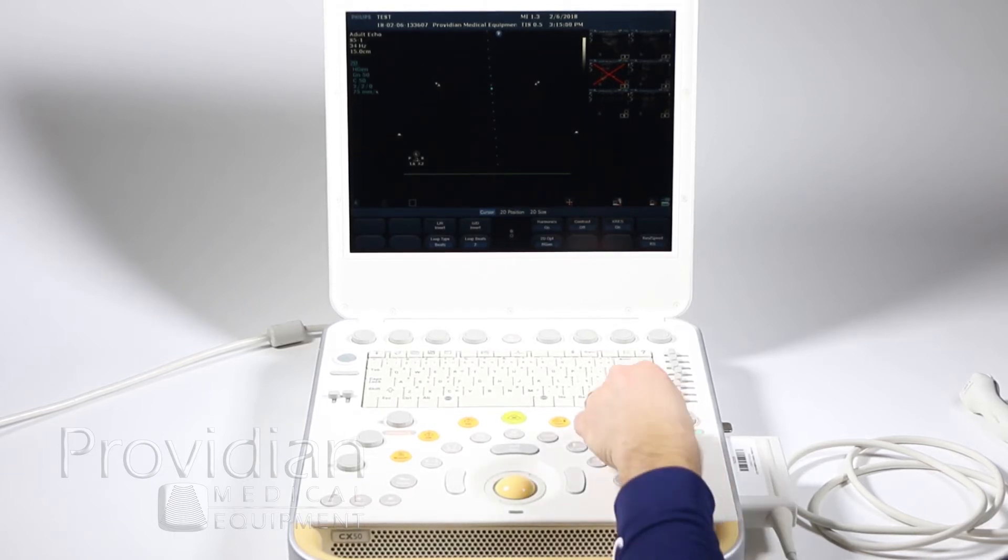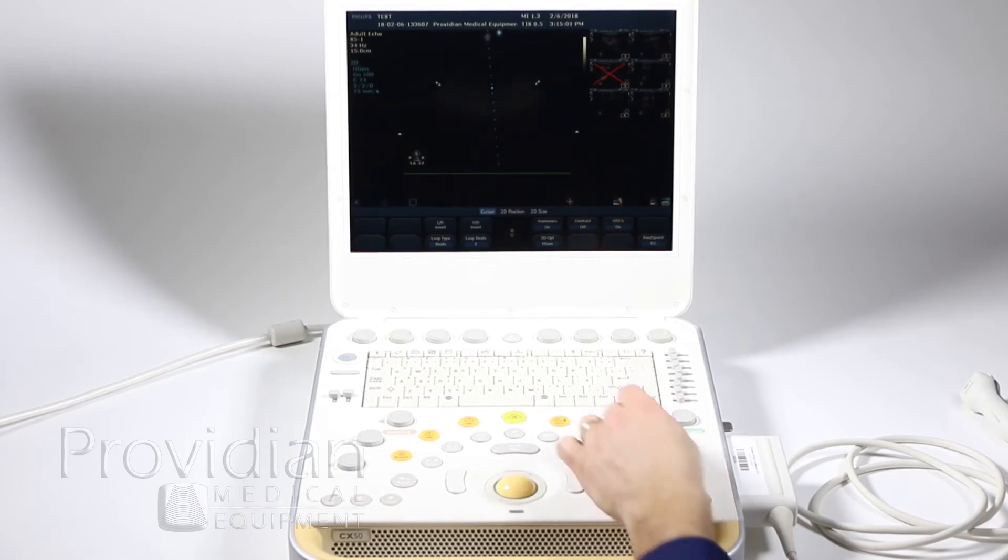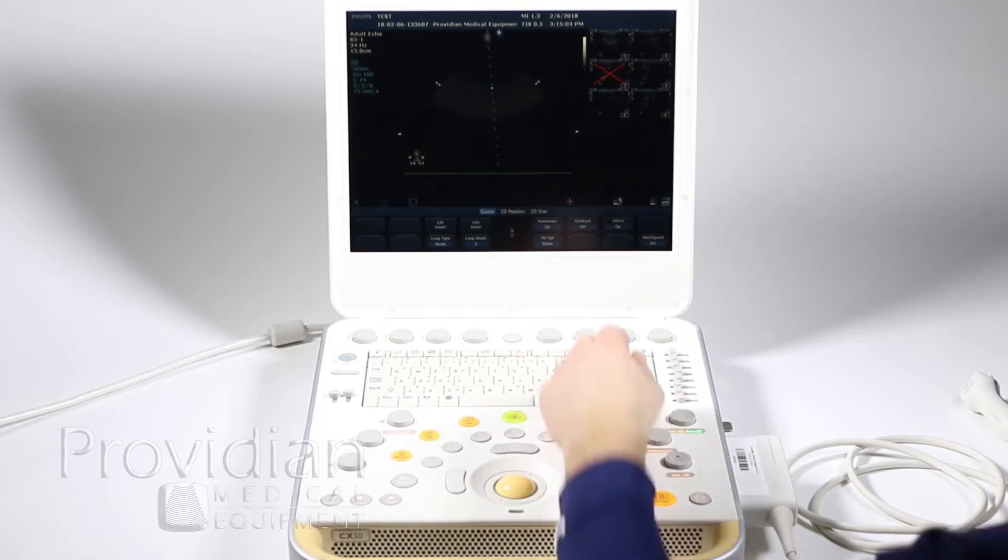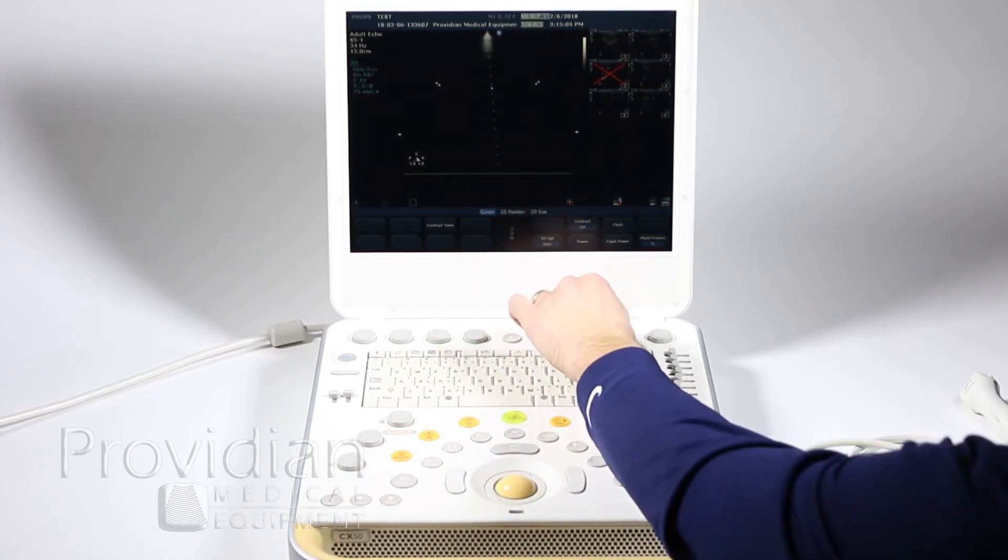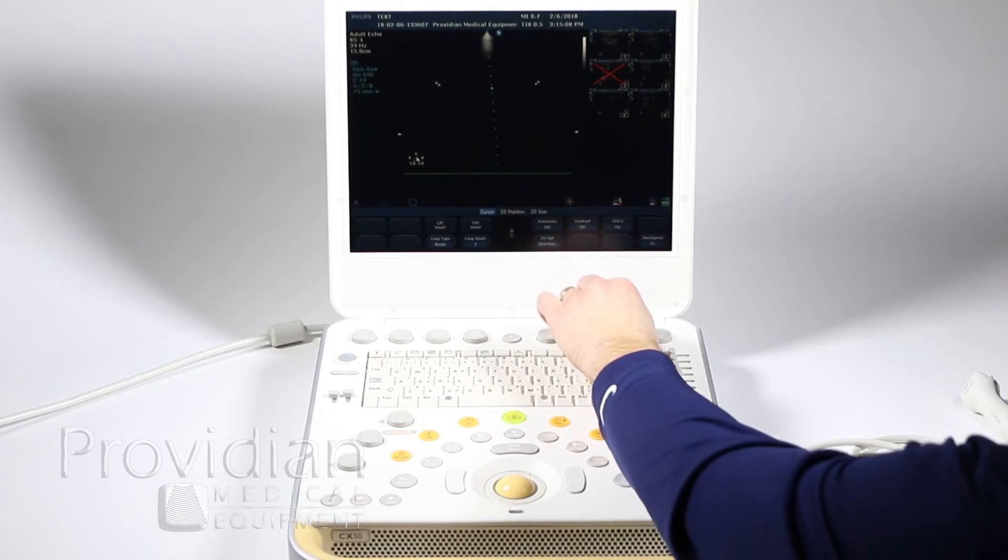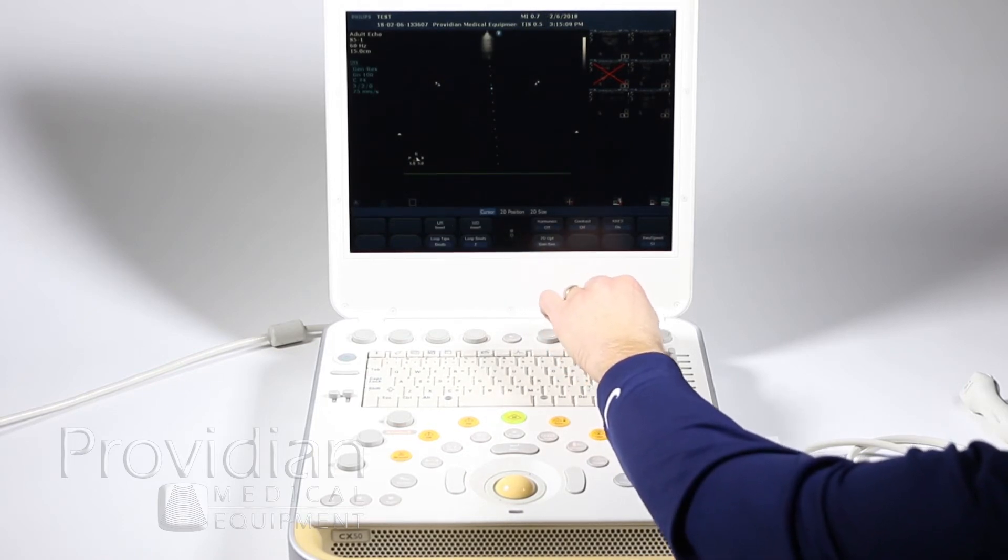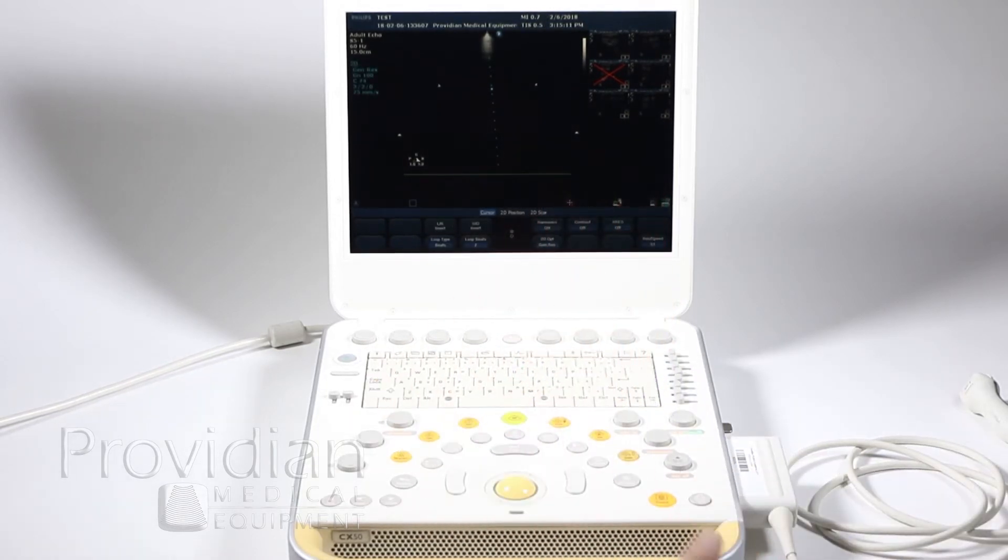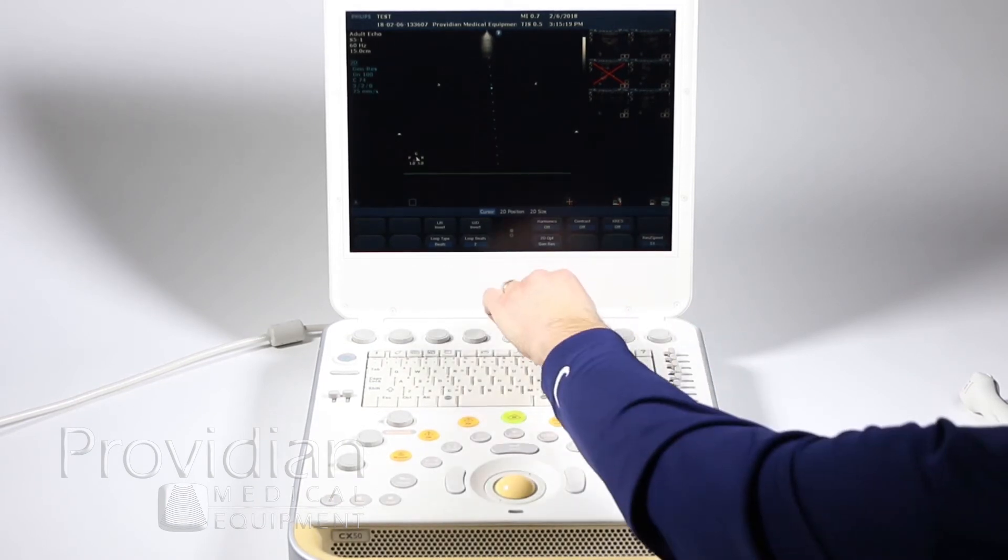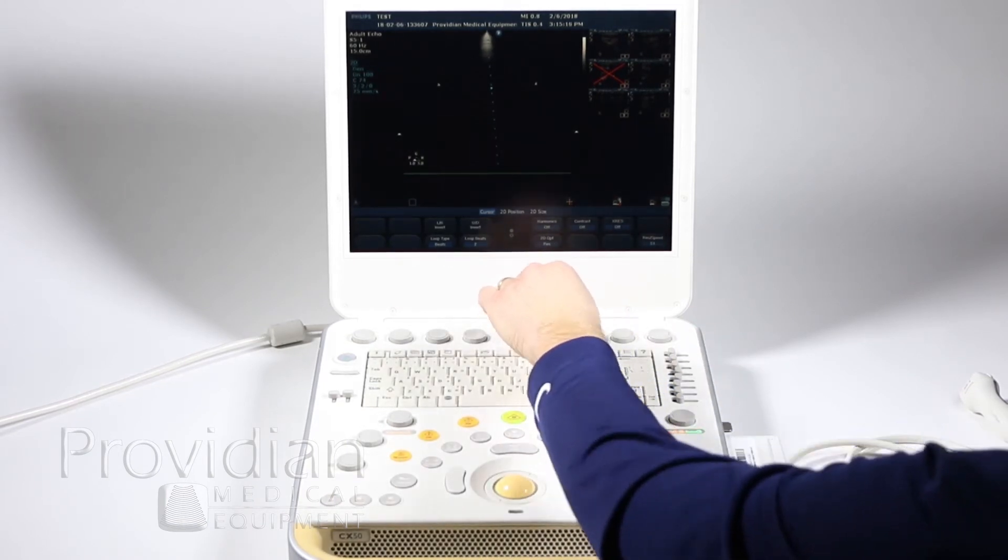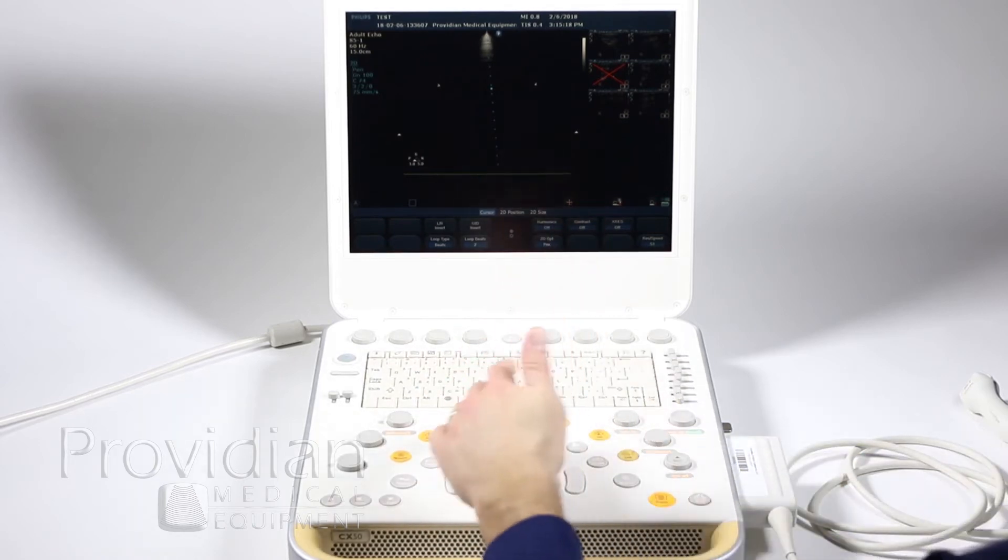Let's say you made some changes to the compression, the gain, you turn off harmonics, turn off x-res and you want to save that because you like the way that is and there may be better penetration. Scroll that all the way down.